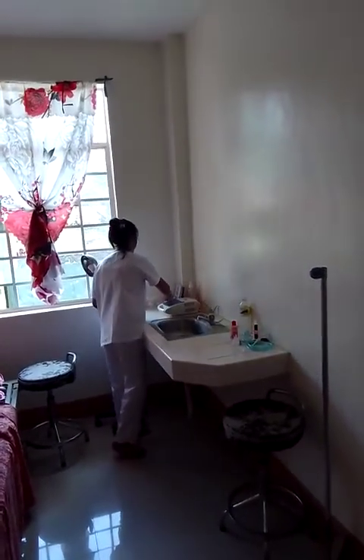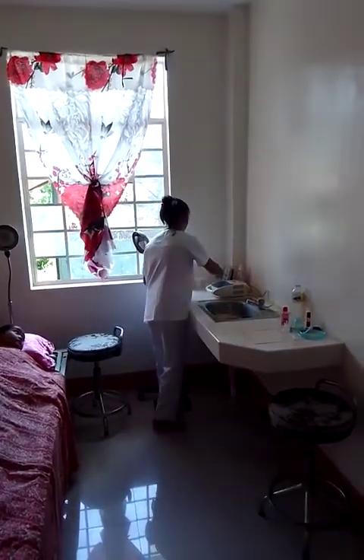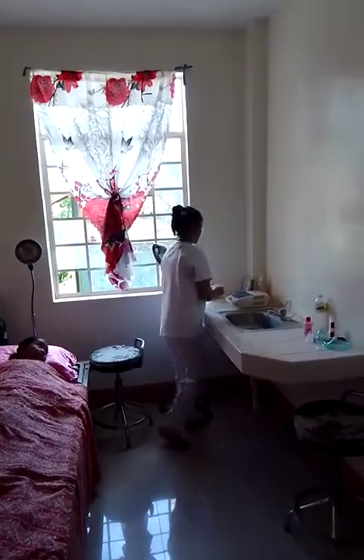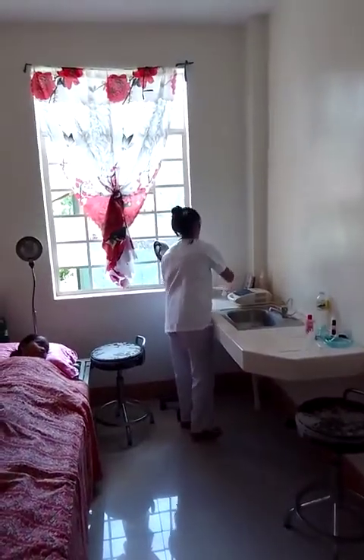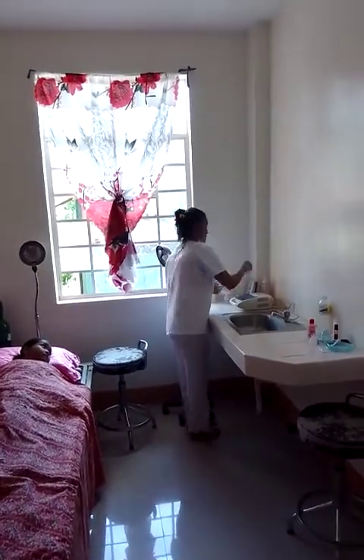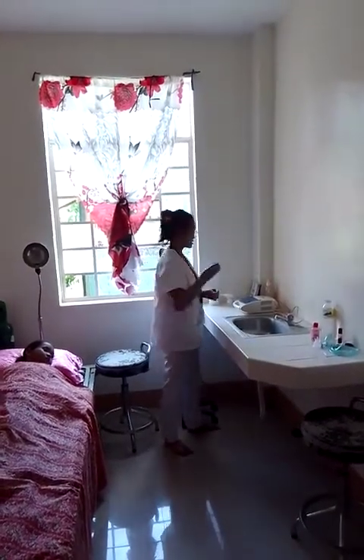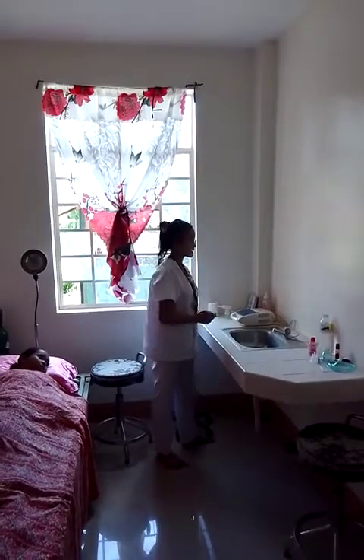I also have here thin plastic tubing, a mouthpiece, a top piece or cup, a medicine cup, and also the medicine. I also have here tissue. And in every procedure, we should not forget to have alcohol.